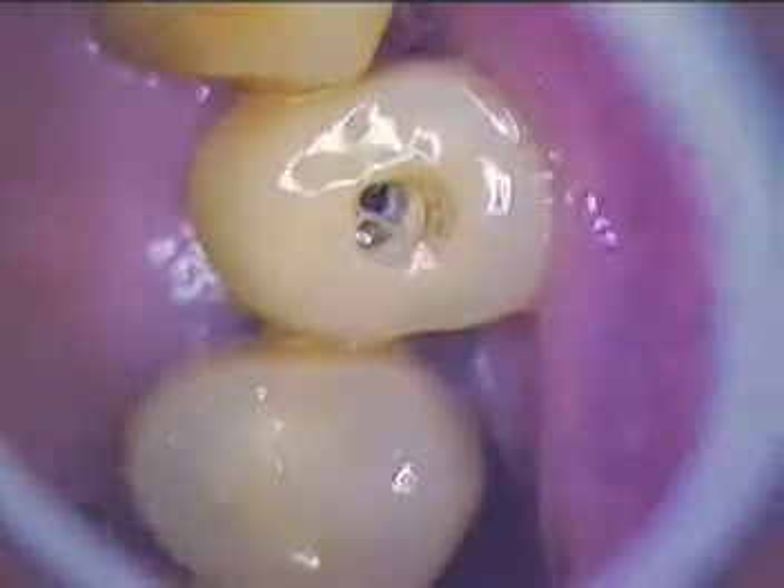Go ahead and insert the screw — we're going to transfer this right to the mouth. I like to condition the soft tissue a little bit, just making sure everything is dry. Let's go ahead and dry the area first.